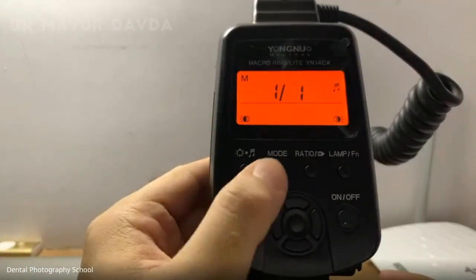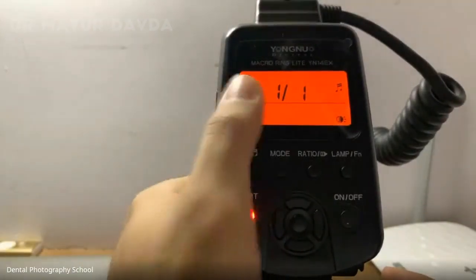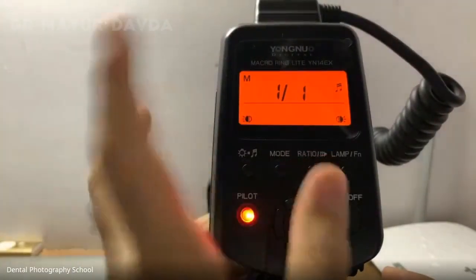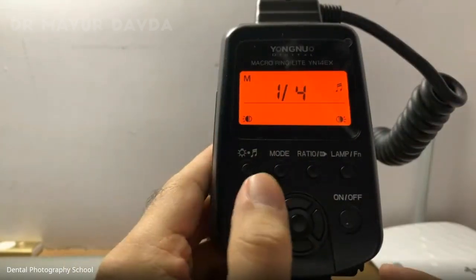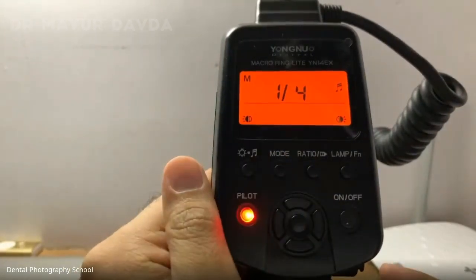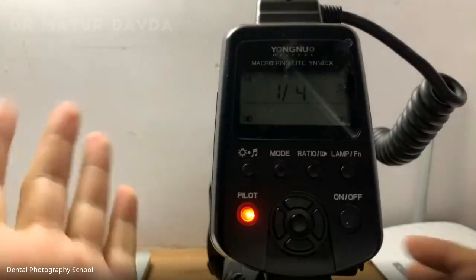There are two modes. ETTL means automatic and manual means manual. In manual, you get to select the power on your own. I have chosen full power right now, but probably for my first image today, I probably want to keep it at 1 by 4th power. So I am all set to take the first shot.